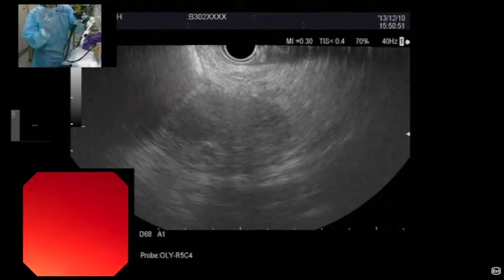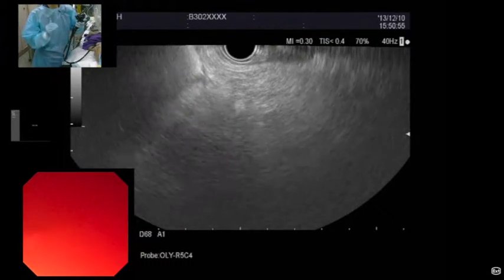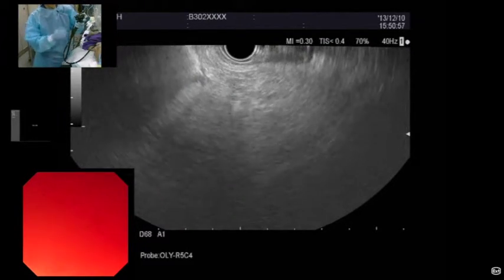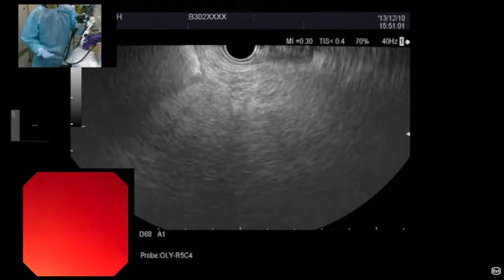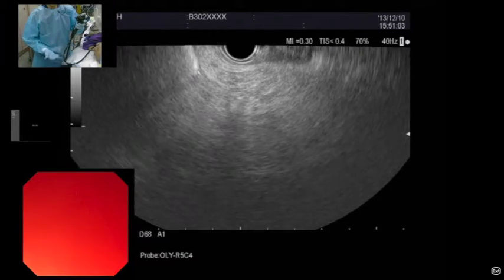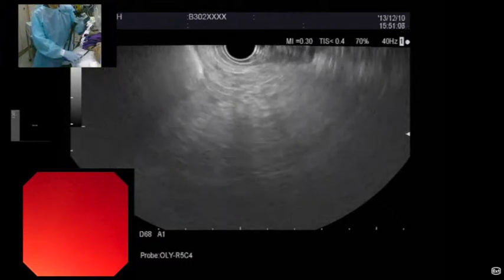We're going to use the stent as a port to do transluminal endoscopy. So we can go into the gallbladder and actually do the equivalent of necrosectomy with our walled-off necroses. We can go into the gallbladder and we can debride and clean out the gallbladder lumen.